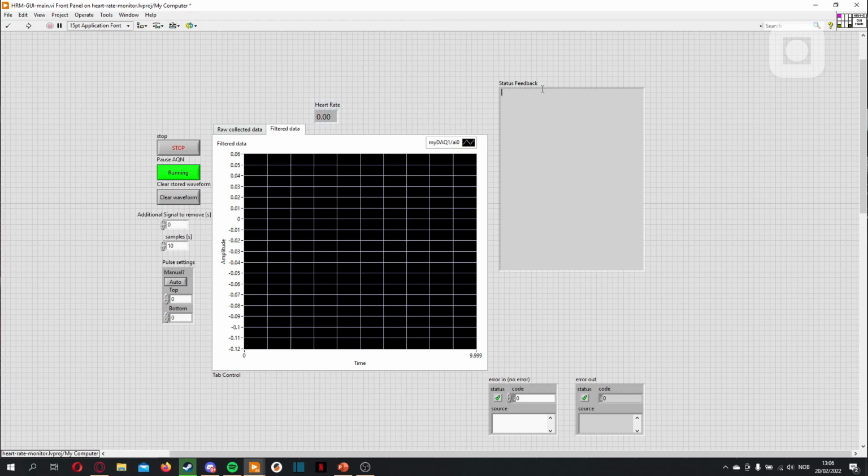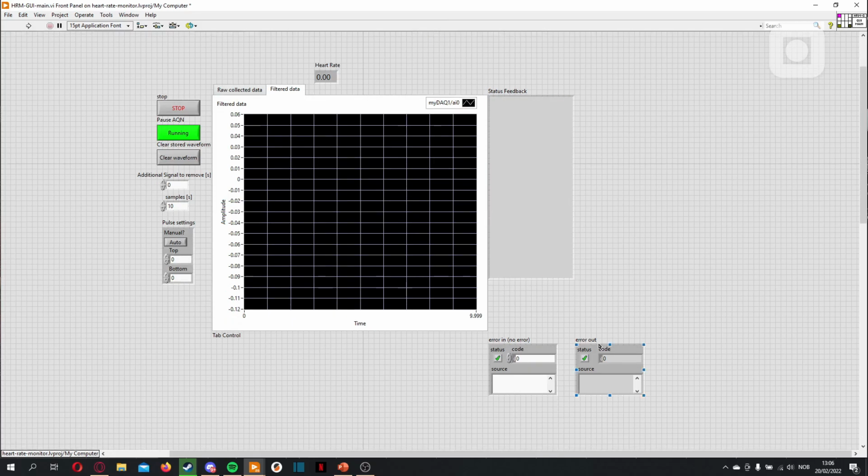Here we go. And we still want the feedback. You can have it there. Make it a little bit more shallow maybe. And then put the error here. You can probably do this a little bit more.